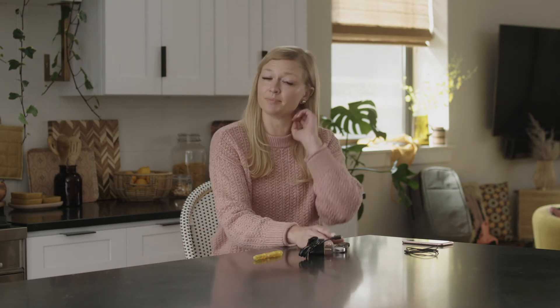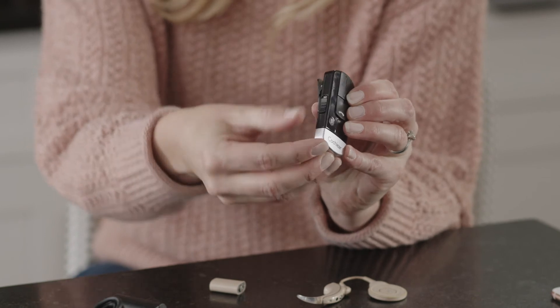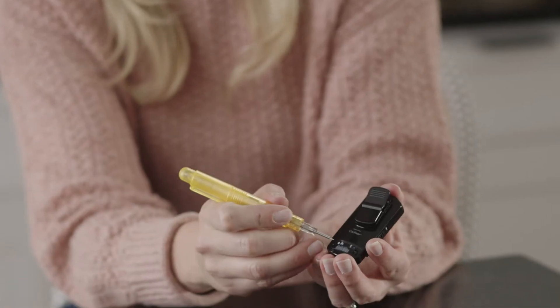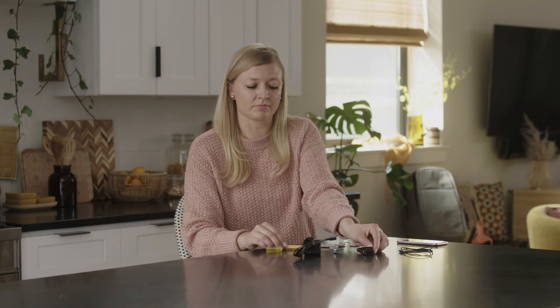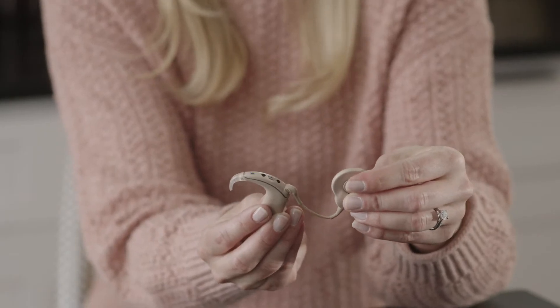Start with your processor off. Turn on the phone clip by sliding the side button down and remove the silver cap. Next, using the included tool found in your kit or any pen, press the white button on the back side of the phone clip. It will flash yellow when it's in pairing mode. Turn your processor back on and a blue light on your processor will indicate that pairing has completed.